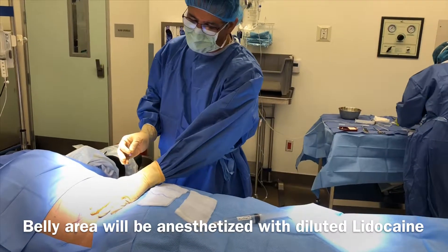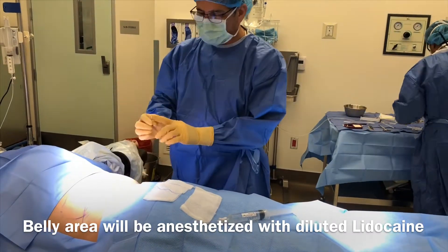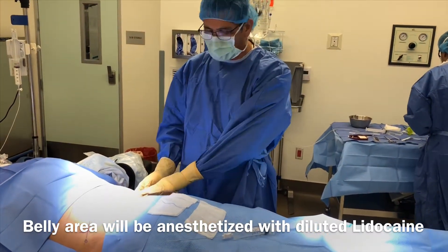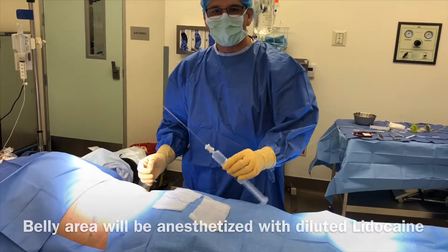I'm Dr. Moore. We're going to go ahead and start the fat transfer with the harvest. The belly is marked off. I just use a very little needle here to make a little nick, and then we go ahead and numb up the area before we actually harvest the fat. That's step number one.